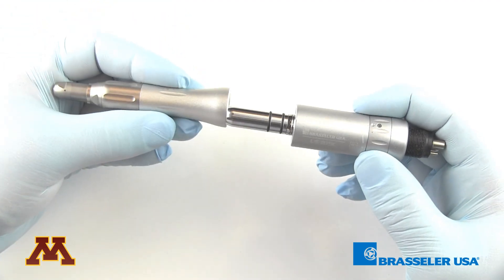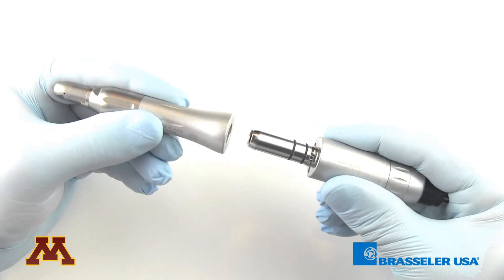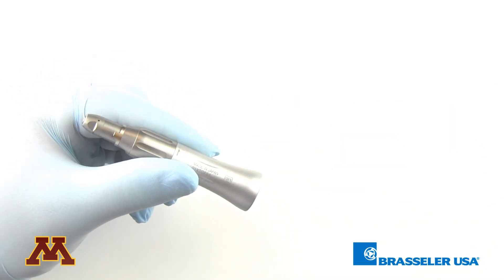The various attachments snap on with a quick, easy connection. In order to remove them, all you do is pull and the attachment comes off.